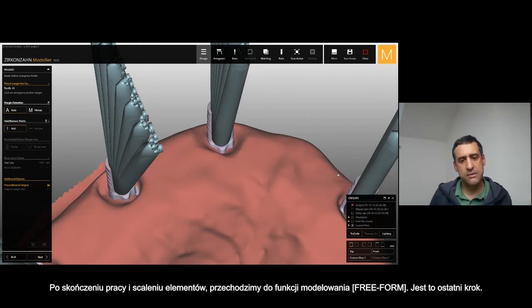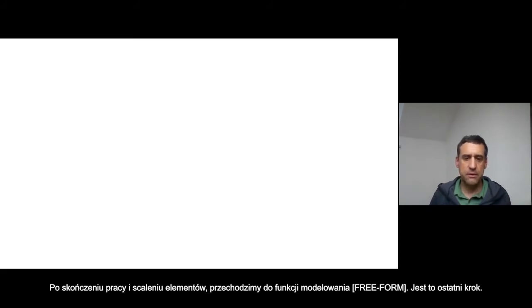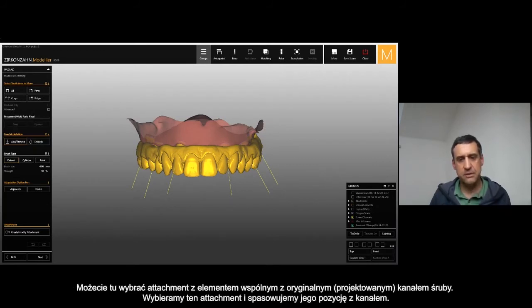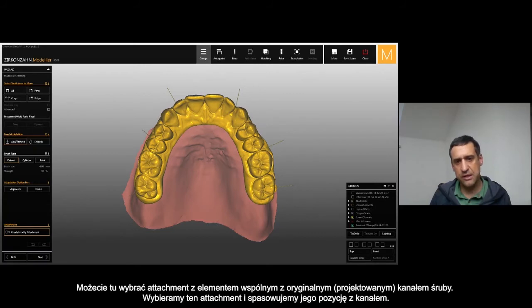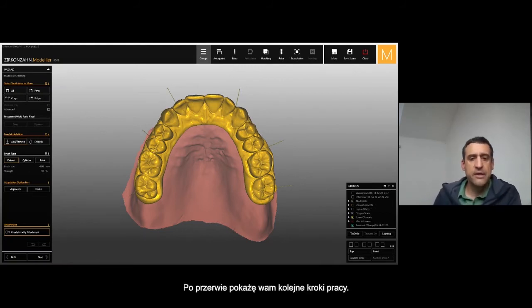Once it's completely finished, merge the framework. Before the final step — in free form modulation, this is our free form at the last step — we can choose attachment. In the attachment option you can align — I will show you in a few minutes — I will take a short break and show you a video about our courses, and then I will be back to show you the next steps.